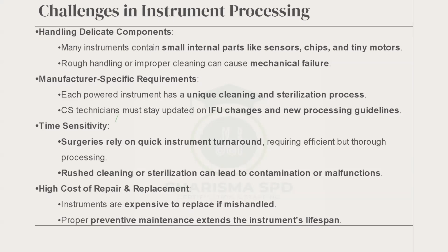Because if you don't do it that way, you are going to damage the handpiece or the instrument. High cost of repairs and replacements, I mentioned that earlier. Very expensive. One probe we have in my hospital costs about $50,000. One. It cannot be steamed, or go through high temperature sterilization. So if you make a mistake and put it there, boom, you just incurred that cost to the hospital.